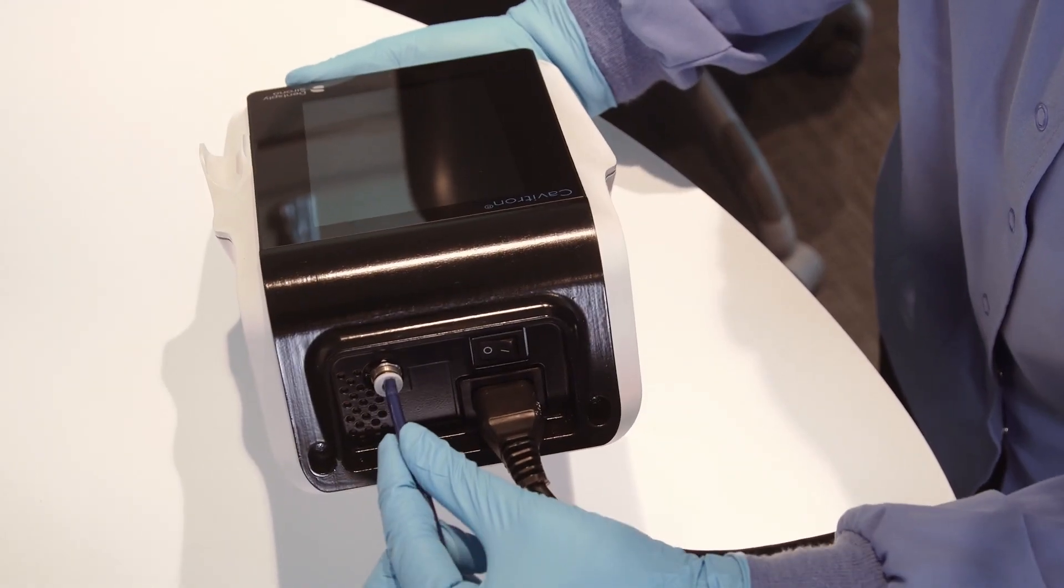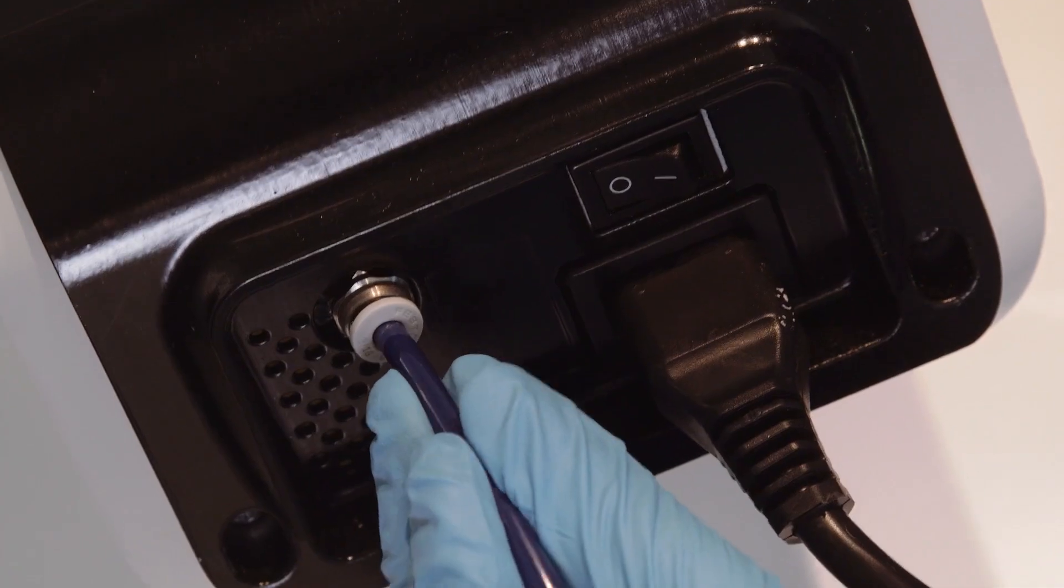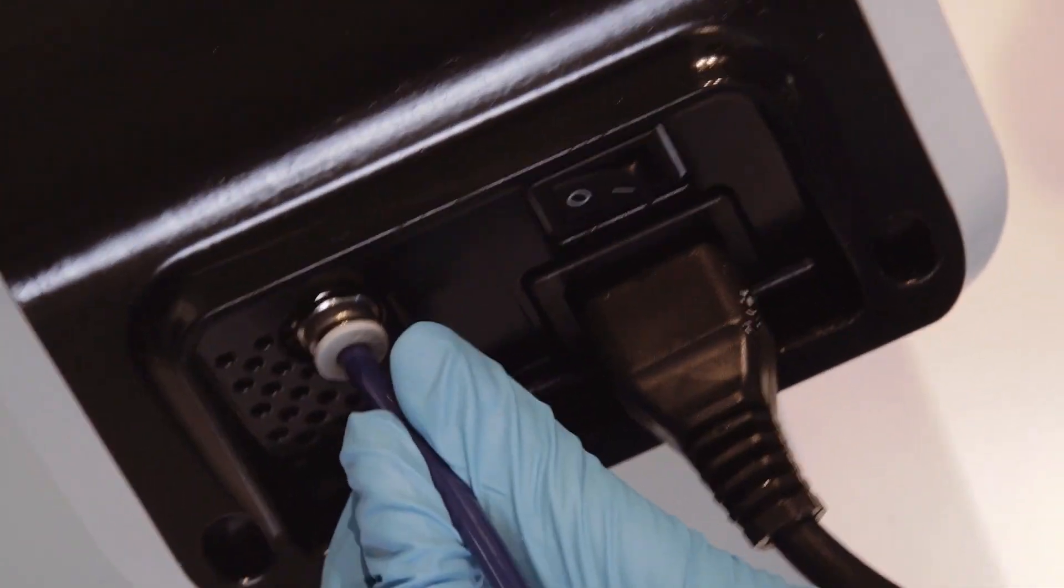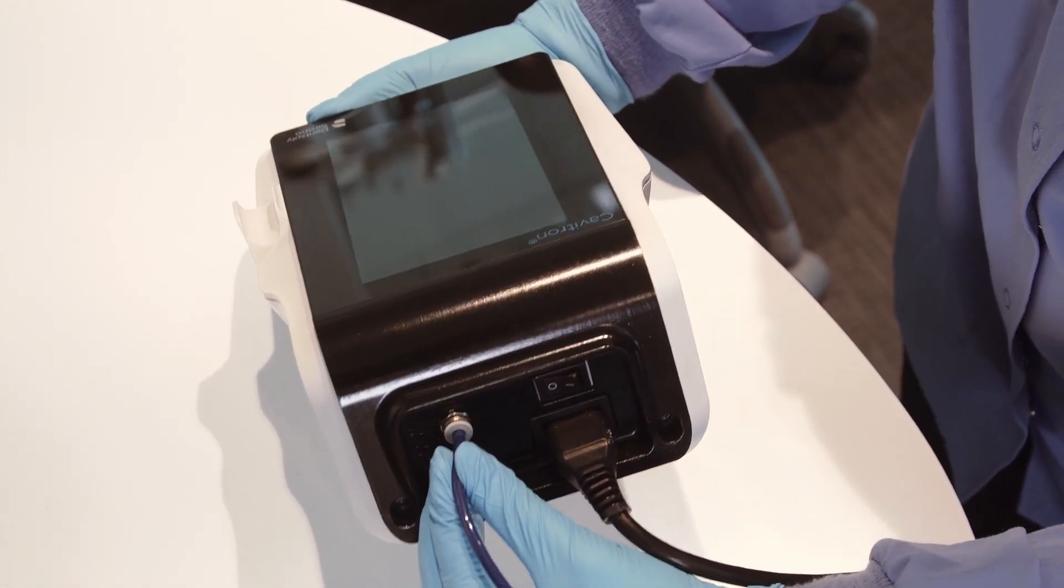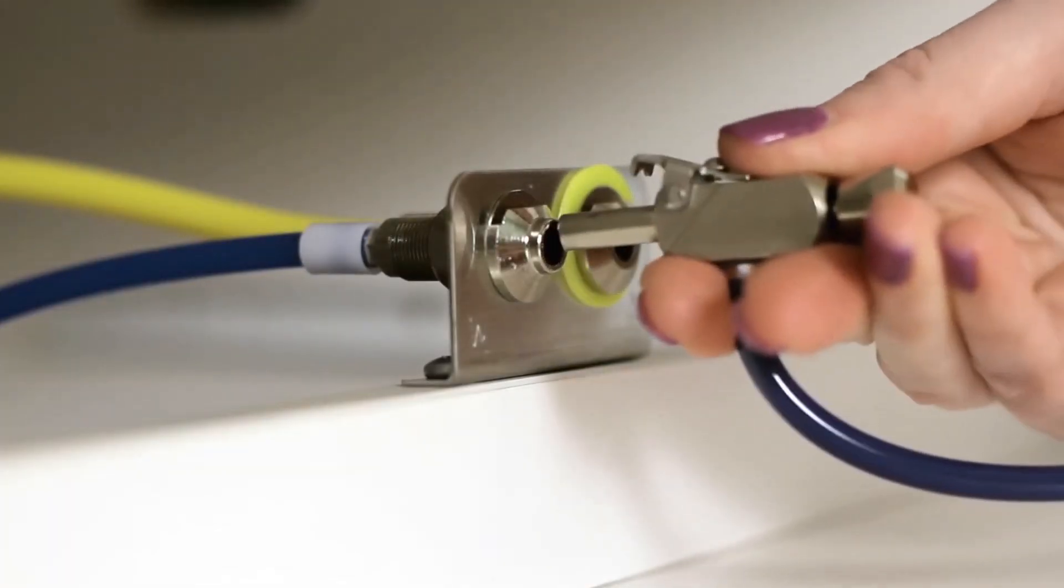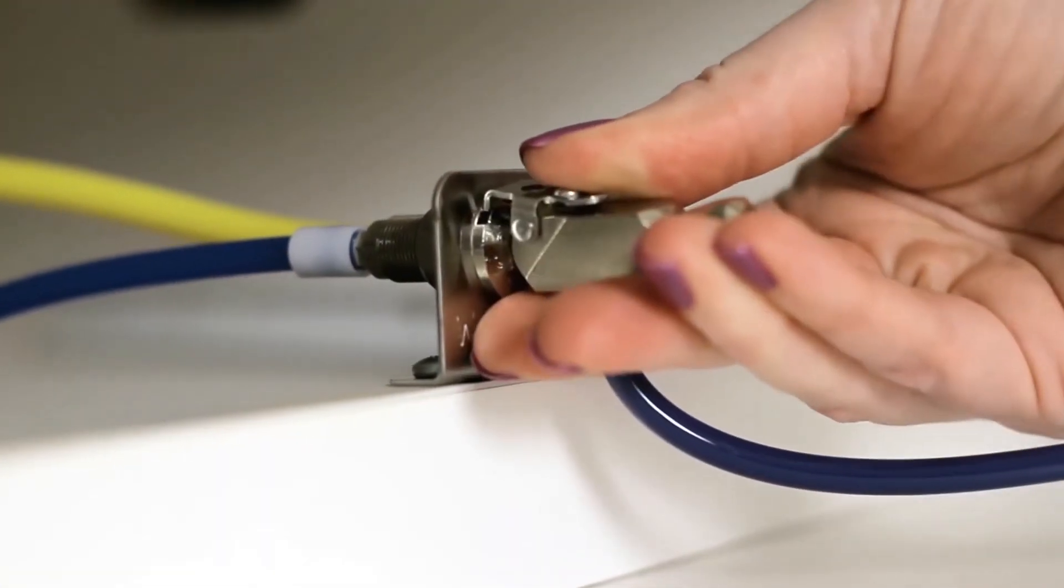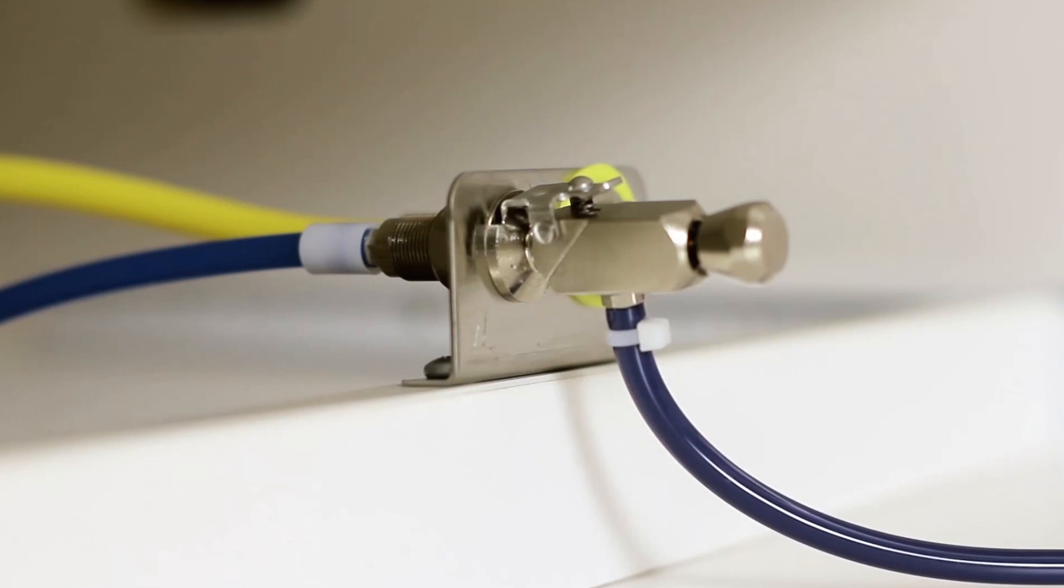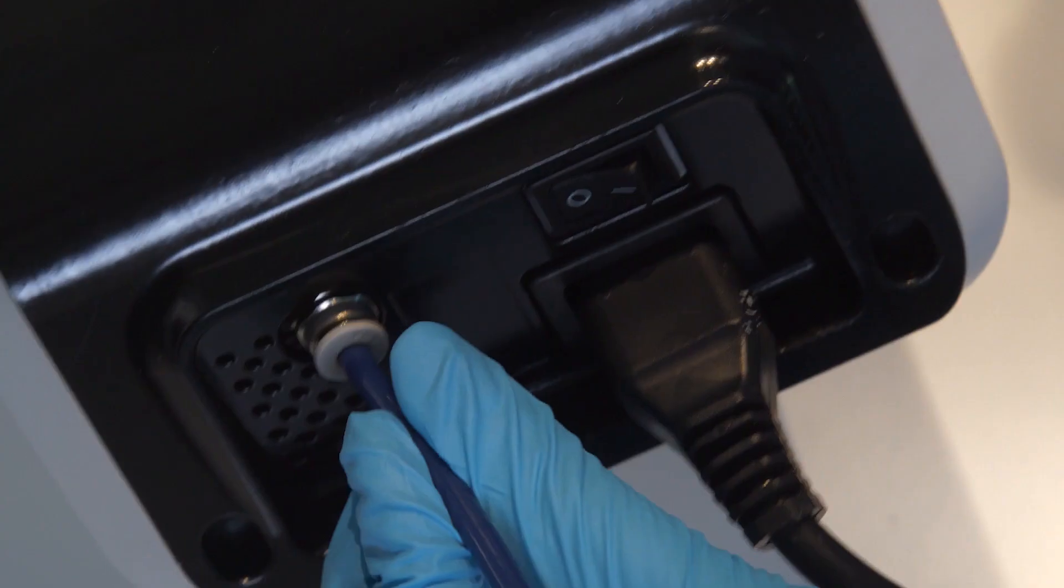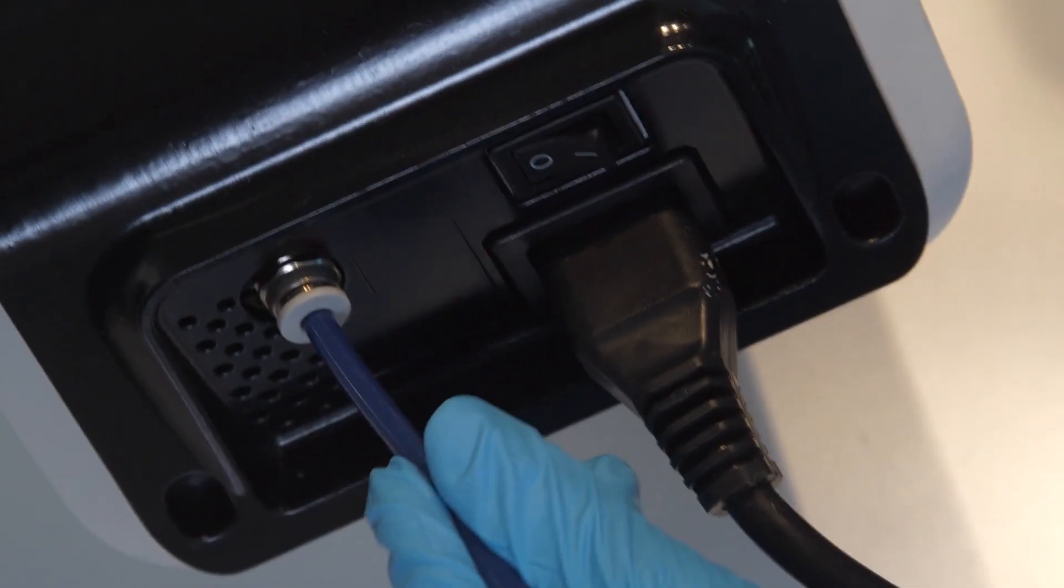To connect the water supply, insert the blue water line hose into the gray water inlet connector until it is fully seated. Tug gently to ensure the water line is secure. Connect the quick disconnect on the other end of the hose to the dental office water supply or a Cavitron dual select dispensing system. Be sure to inspect all of the connections to make certain there are no leaks.